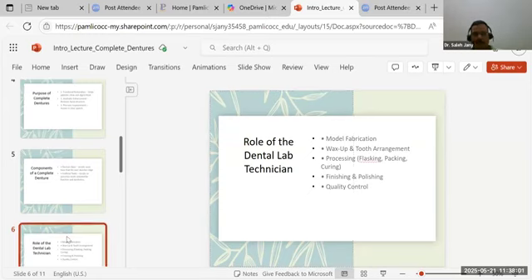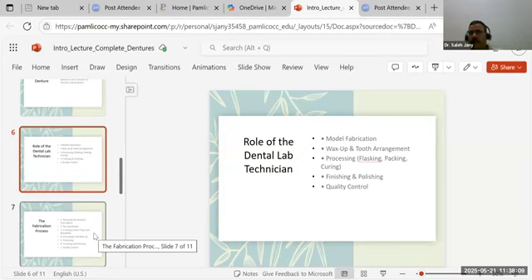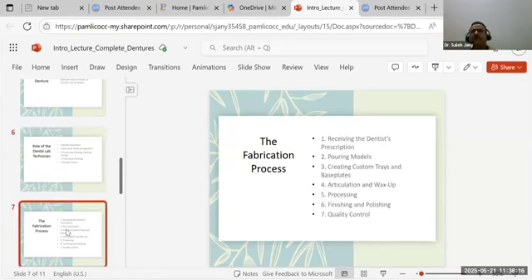And most of the dental labs have quality control. A senior dental lab technician does the quality control. They check the occlusion, the bite, the color, the shade. Most of the patients go with B2 and D2. I'm D2, but because of the coffee and stain, I'm getting stained, so it will be D3. So most of the patients are D2 to D3.